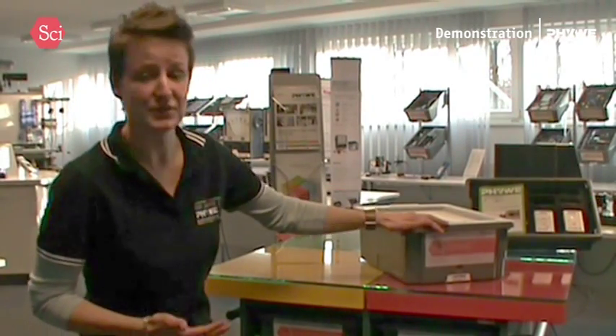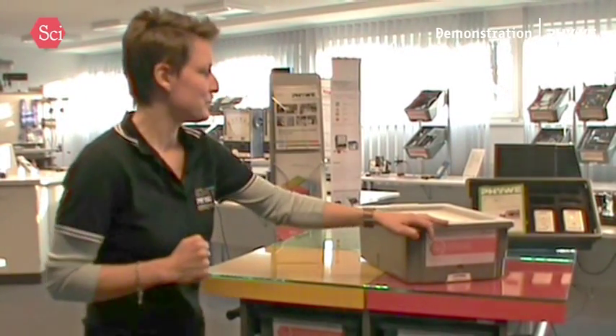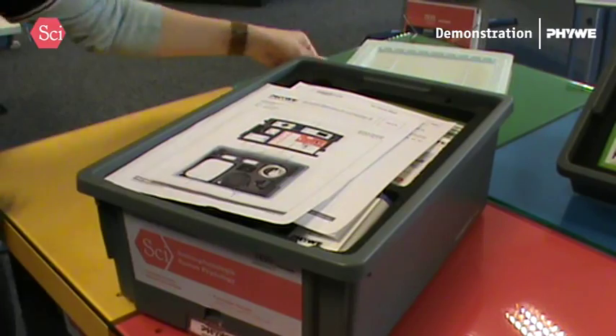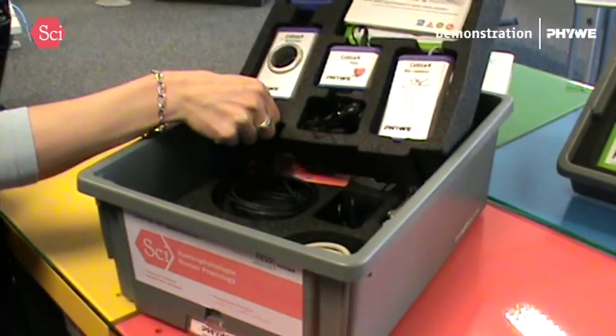So this set here, the human physiology, is from the applied science part of life. It's actually a discover your body set — to be exact, the extension to the electrophysiology set you might eventually already know. What I have here is one practical, easily stackable box which is going to cover a few core topics about my body.